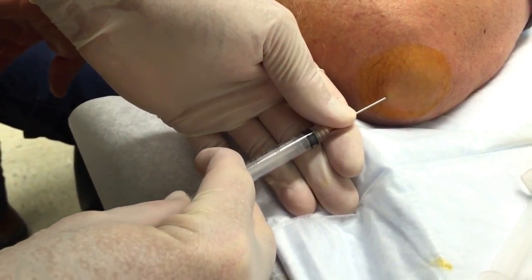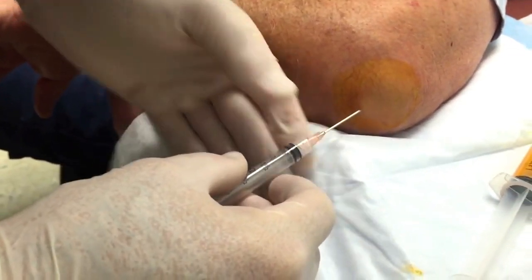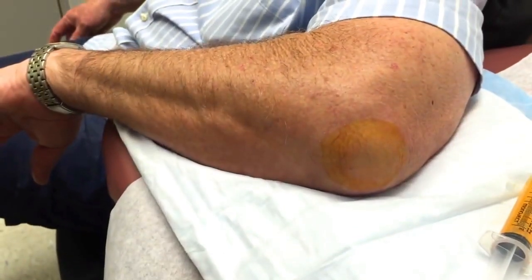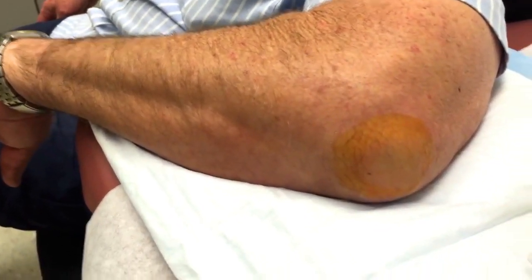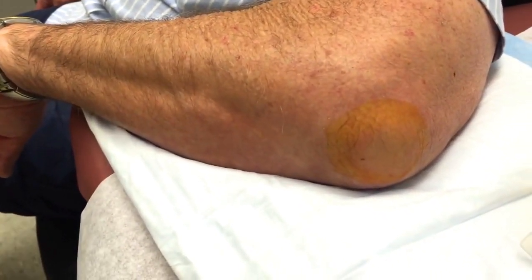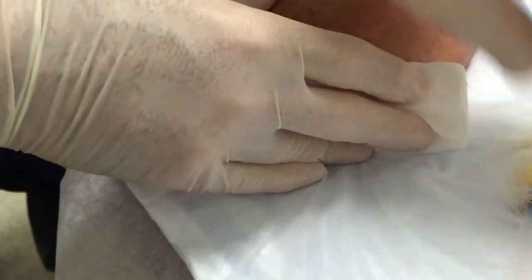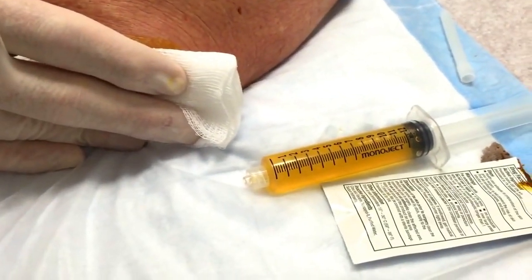Now we're gonna push a little cortisone in there. Gonzo has failed to get me a 4x4. You did really well — how was that on a scale of 1 to 10? A one! Check this out — holy mackerel, that was inside there. That's right, all finished!